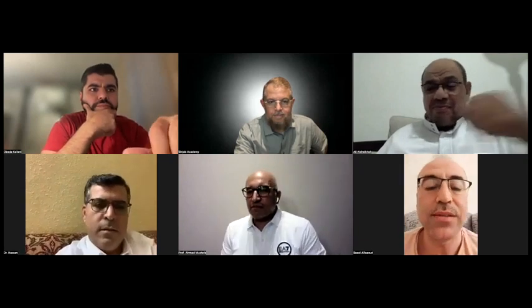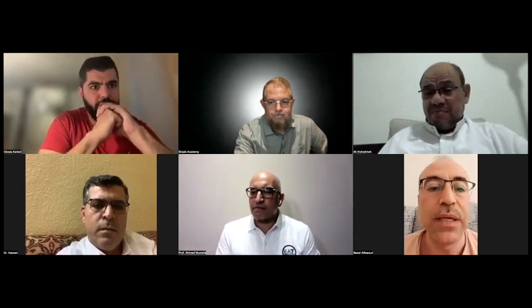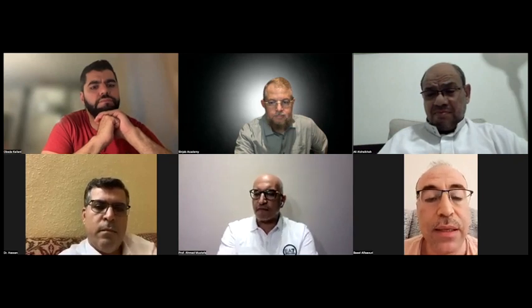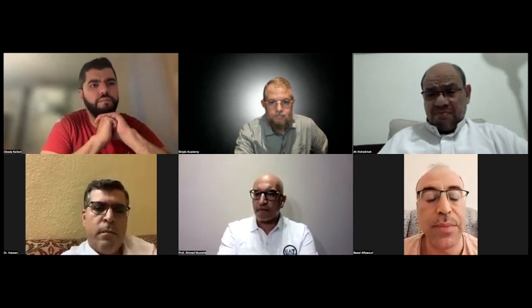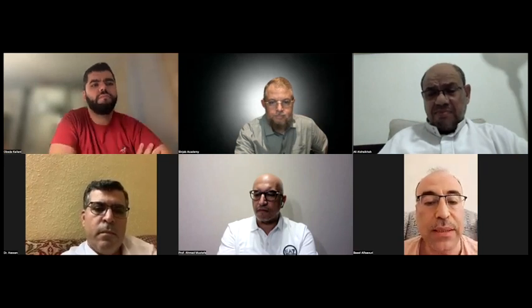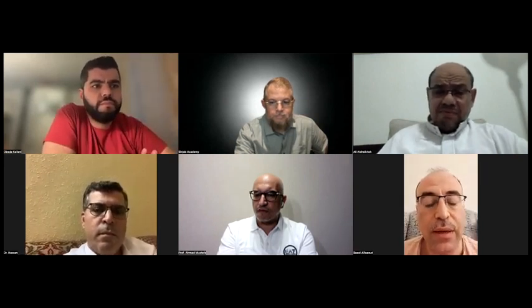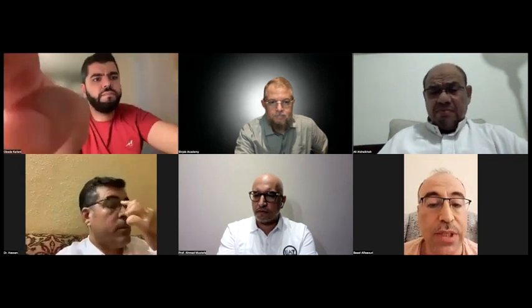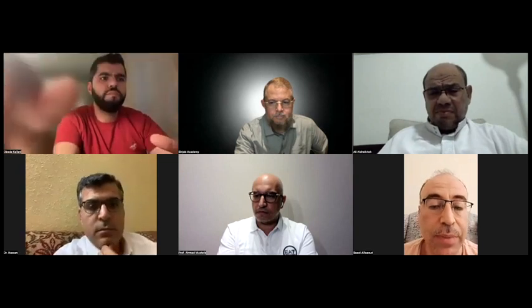Dr. Ahmed and my colleagues, if you can accept my notice about the recent iStent drainage system. Indeed, the tube of the device is rigid. It's not as in the Ahmed valve or the Baerveldt. So you will not worry about the direction of the tube in this case, because it's rigid, and it will be parallel to the iris.